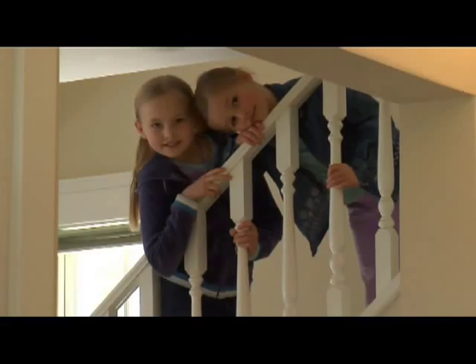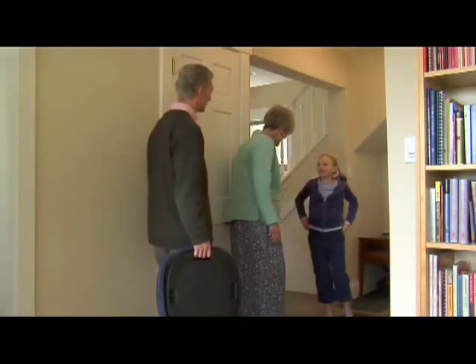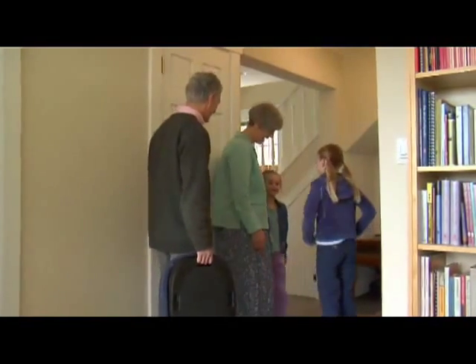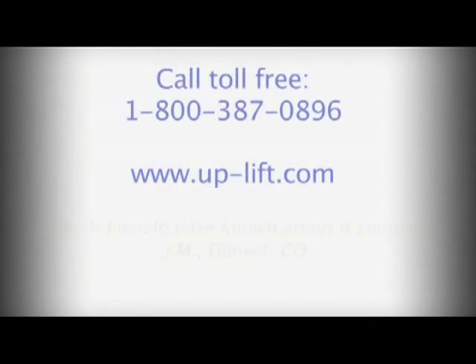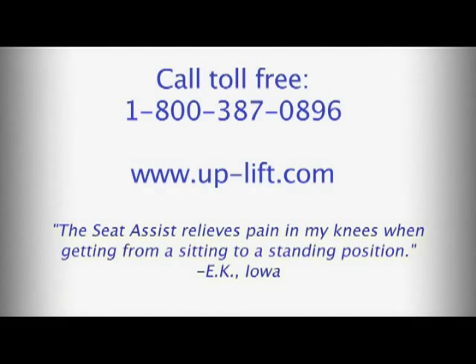To transport your Seat Assist, push down on the flexible seat cover, gently release the lifting mechanism inside, close the cushion, and attach the Velcro tab — then grasp the handle and go. Whether it's a temporary condition or for day-to-day use, the innovative Seat Assist will help keep you or someone you love active and independent. To learn more, call toll-free 1-800-387-0896 or visit our website at www.up-lift.com.